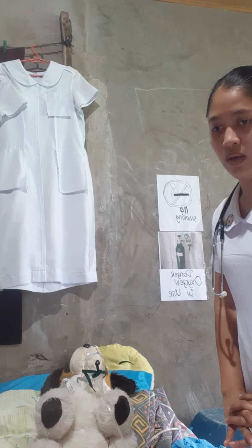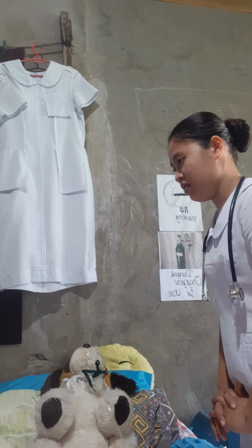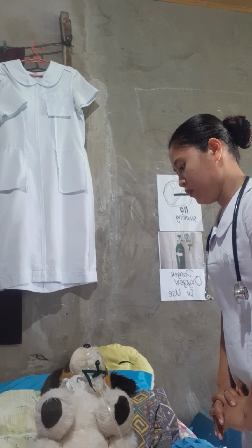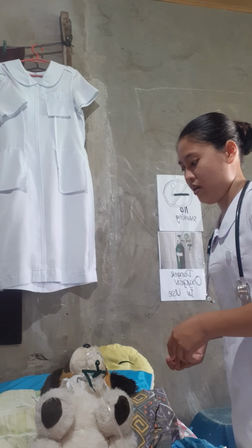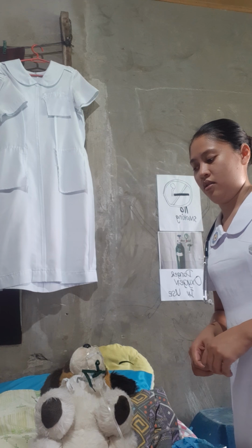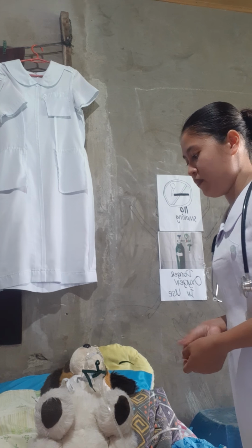So, sir, I am going to administer tracheostomy care for you so that we can remove the secretions and change the dressing for your tracheostomy, and so that it will help you feel comfortable and keep you away from infection.